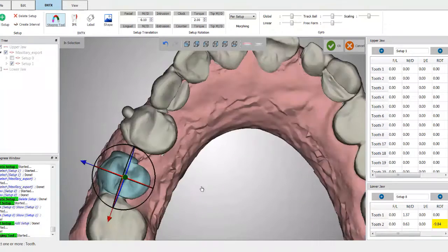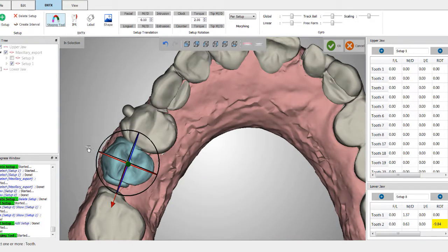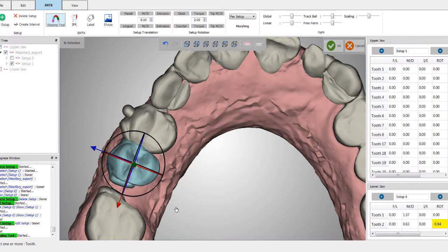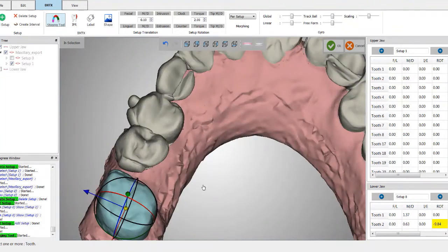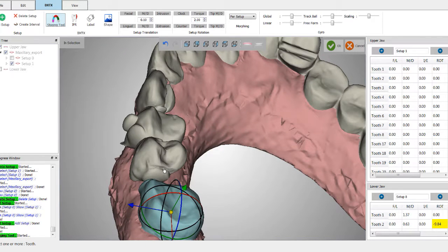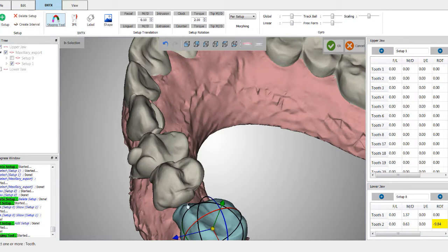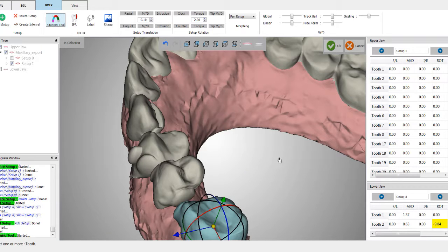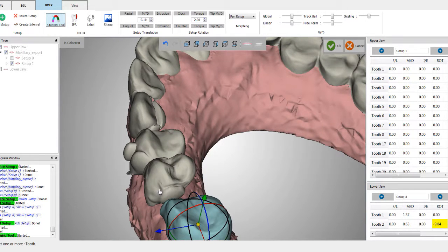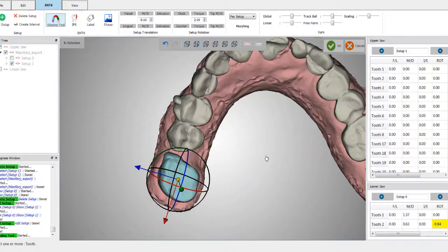And so you can use that sort of as a guide, particularly in cases with lots of crowding, to determine really where the real tooth structure stops and where the scan was not able to capture any data at all. So, for example, in this tooth here, this right here is actual scan data. This right here is all artificial. All of that there was not captured by the scanner at all. So we wanted to build in a convexity, so that the aligner would not go into that area, and so there would not be a negative shape in the aligner, if that makes sense. So we built in sort of a safety or a buffer shape in between the teeth there.